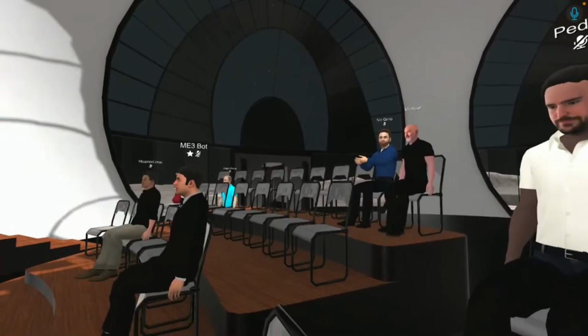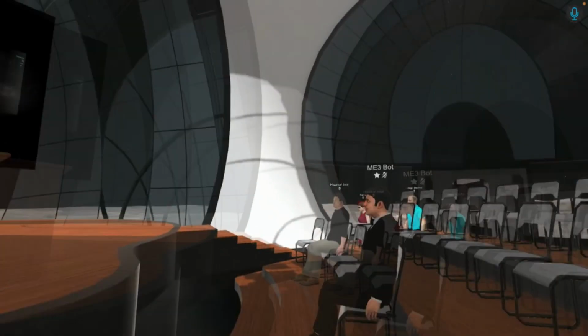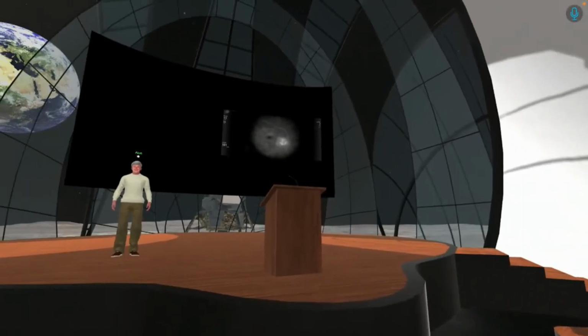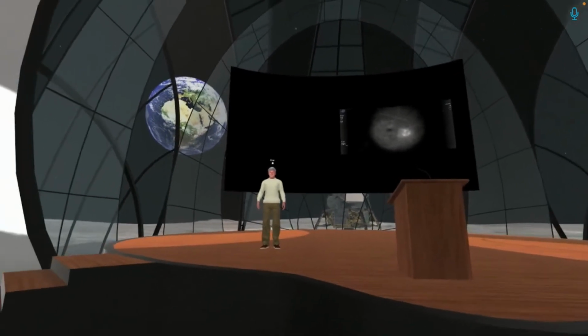But I'm not saying that we can't see them like this. I totally agree with you. It's just that I find that blue-green contrast could give you a little bit of leverage sometimes when the leakage is very small. But then again, you guys have done a lot more intraop FA than me.